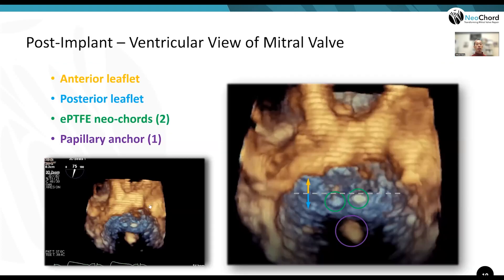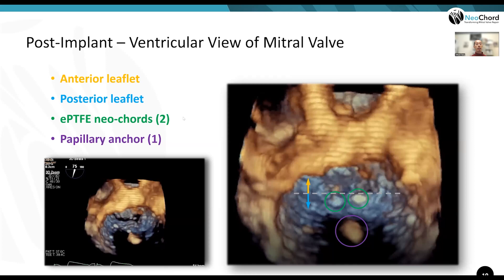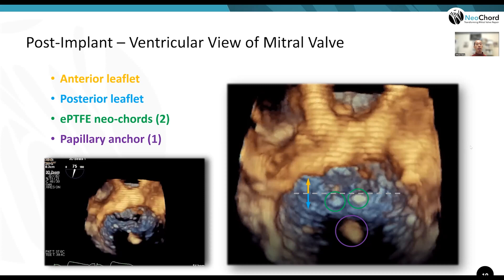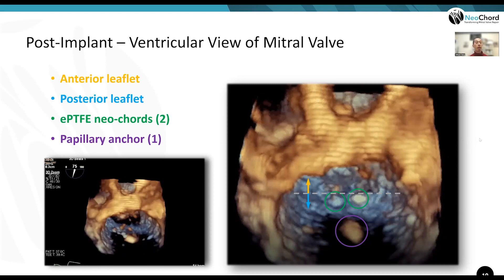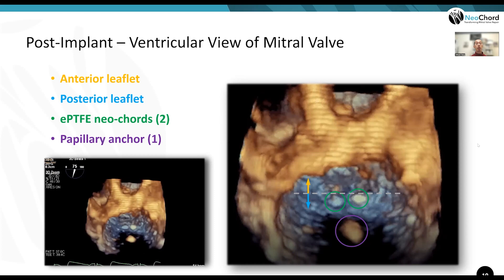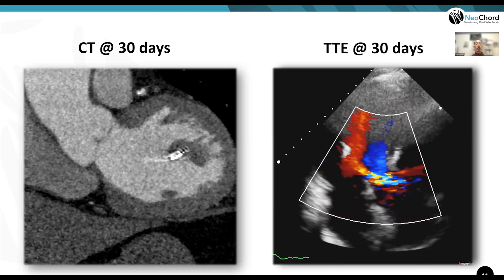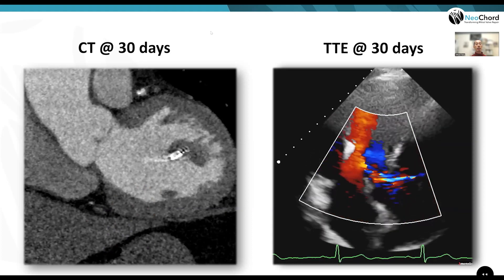A ventricular view of the repaired valve shows anterior at the top and posterior at the bottom. The two cords are quite echogenic, as is the papillary muscle anchor. This procedure is very echocardiography-friendly — a key advantage also seen with the prior transapical approach.